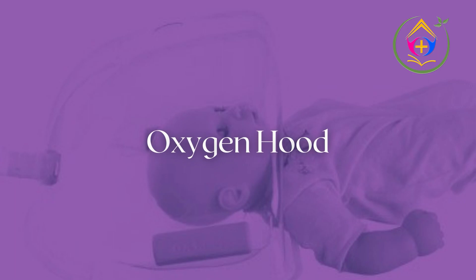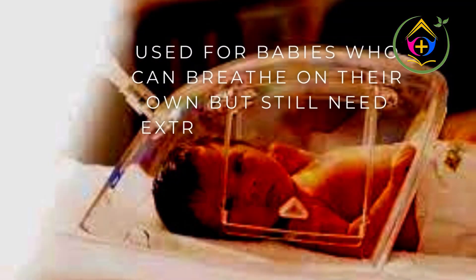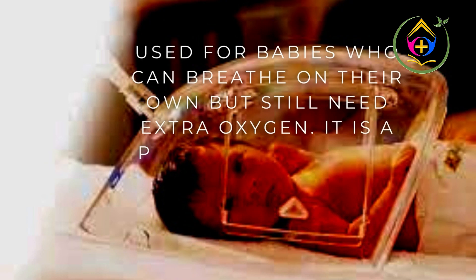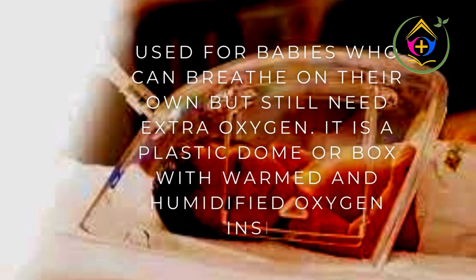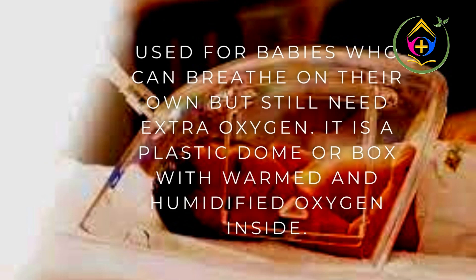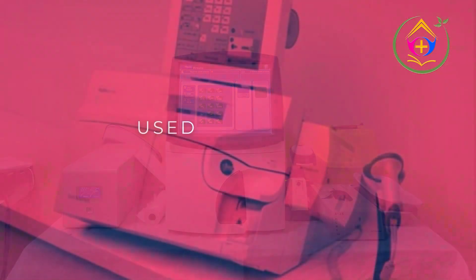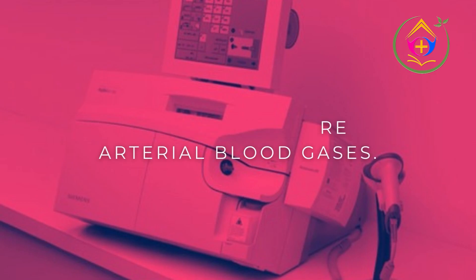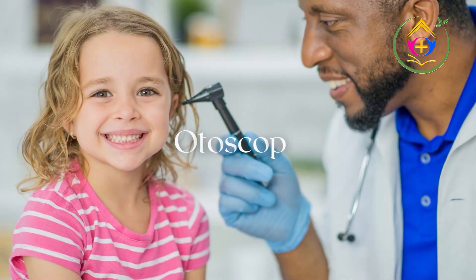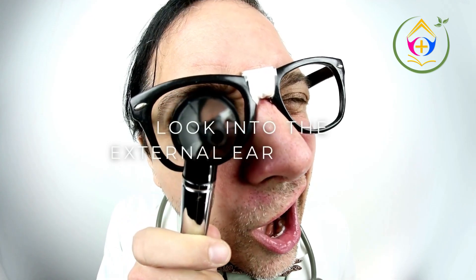Oxygen Hood: used for babies who can breathe on their own but still need extra oxygen. It is a plastic dome or box with warmed and humidified oxygen inside. ABG Machine: used to measure arterial blood gases. Otoscope: used to look into the external ear cavity.